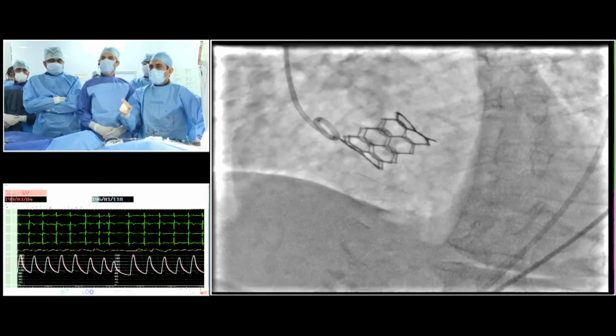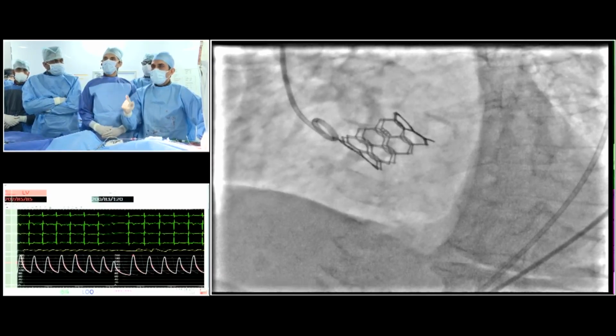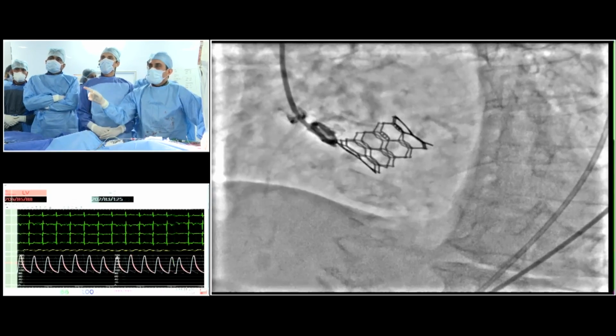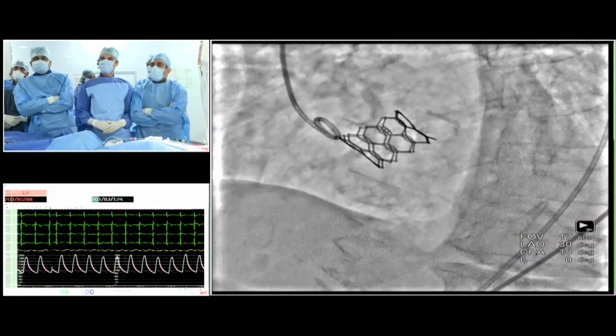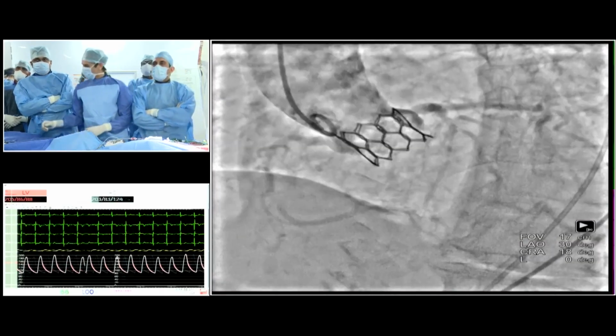Just one thing which I want to share, Professor Seris, because everybody is there. We did the first in man case 6 years ago. That patient is still there with single digit gradients. Let's go ahead, inject. So I think we will see no change in ECG, there will be no paravalvular leak, a very successful and good story worldwide.